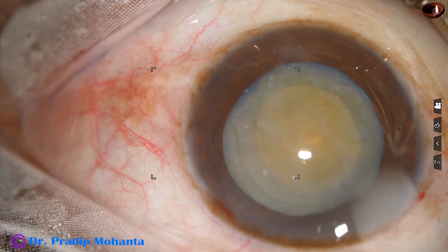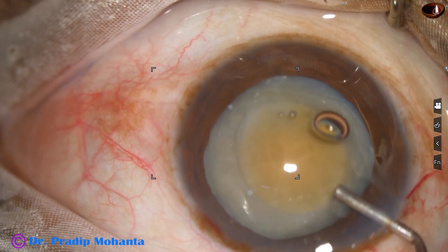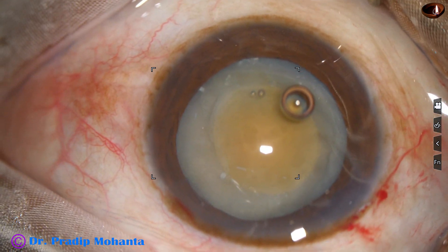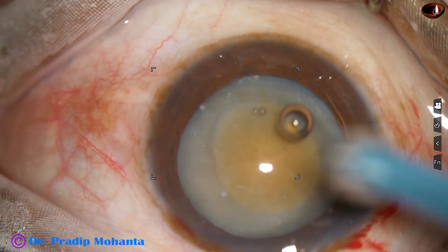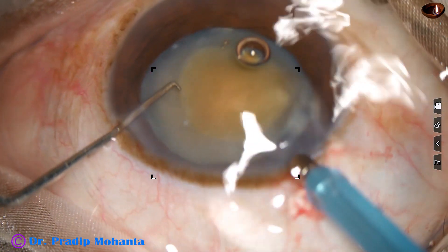Zonules may be very weak in hypermature morganian cataracts. There can be zonular dialysis if the rhexis goes to the periphery and if I try to pull that rhexis.